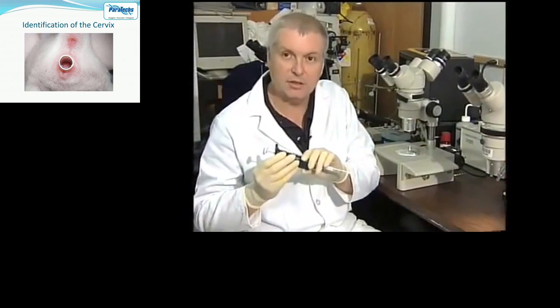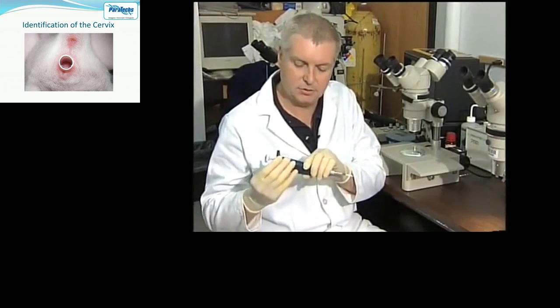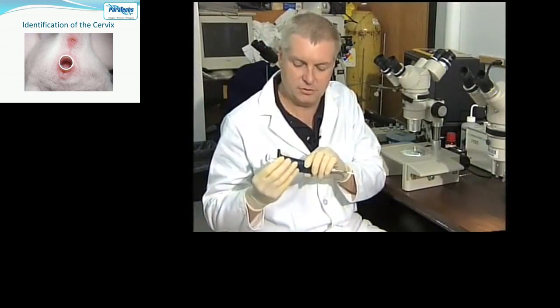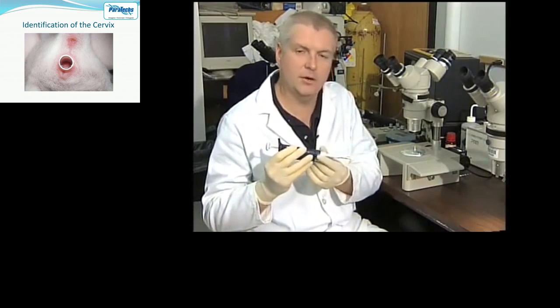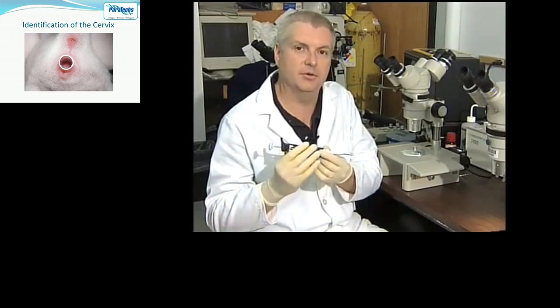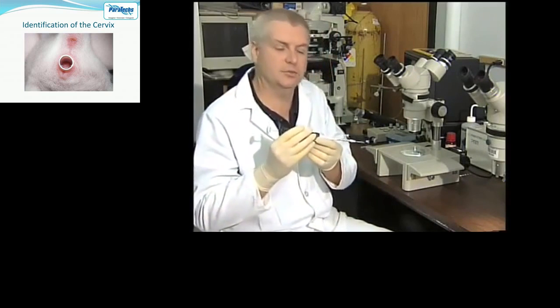Once you've loaded the NSET, then just dial up to 2.00 microliters on your pipettor. This will introduce a small air bubble at the tip, and that'll help keep your embryos from wicking out when they touch the inside of the mouse, until you get it to where you're ready to expel the embryos.